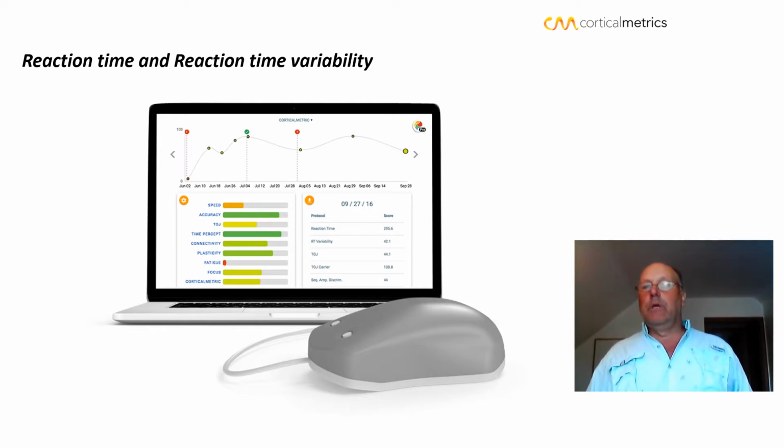Reaction time variability is a little bit different. As you take the reaction time test, you'll notice that you'll see numbers flash up on the screen, and those are your trial by trial scores. Basically you have 10 or 15, 20 trials, and what we're interested in for reaction time variability is how much those scores varied.